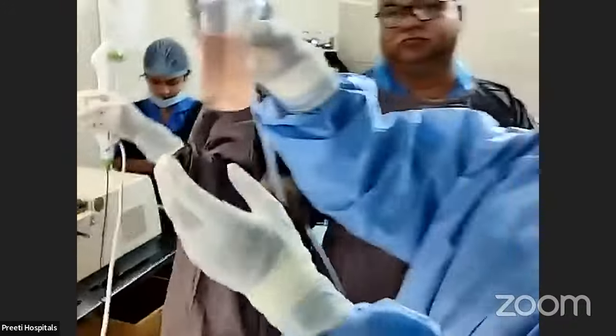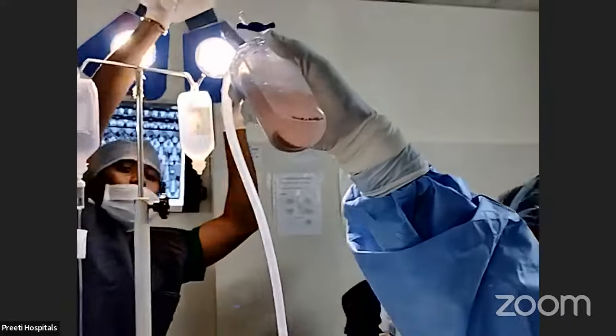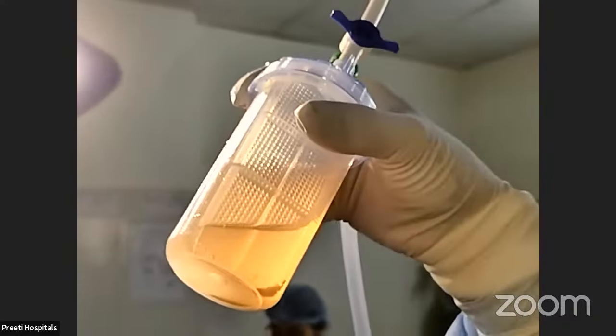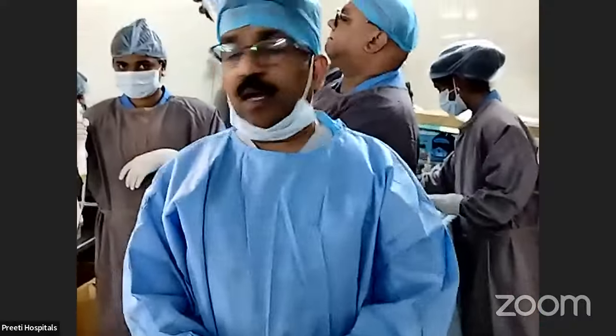This is the powder completely which has come. Can you observe that in front of everything? This is the powder. You see, it's visible clearly. See the powder and some fragments on this side. Can you see? This is true powder. These are the two fragments. That's all. To conclude, don't remove the guide wire.